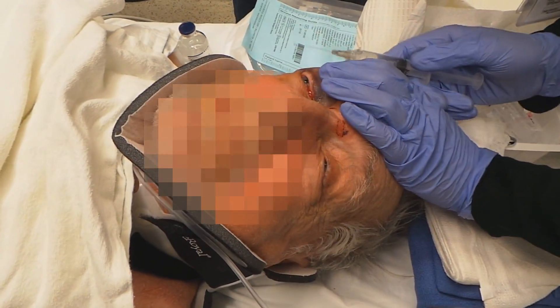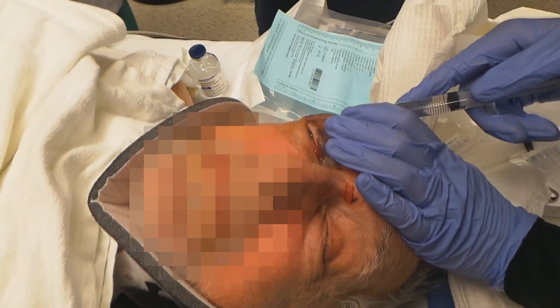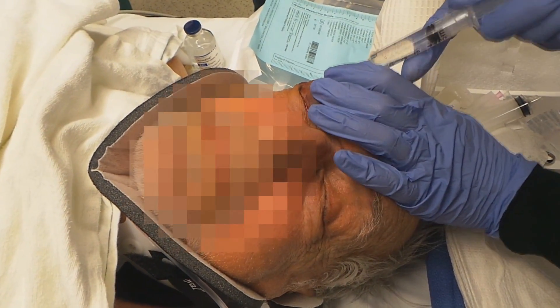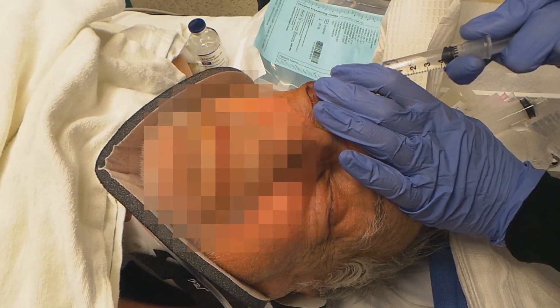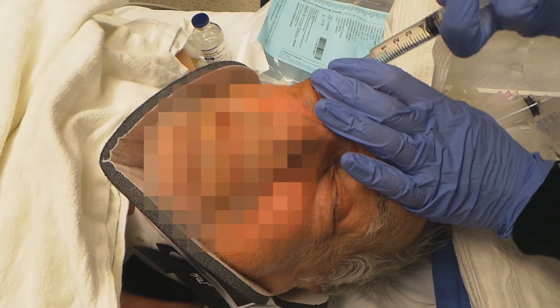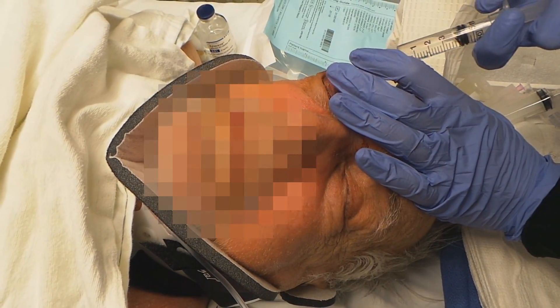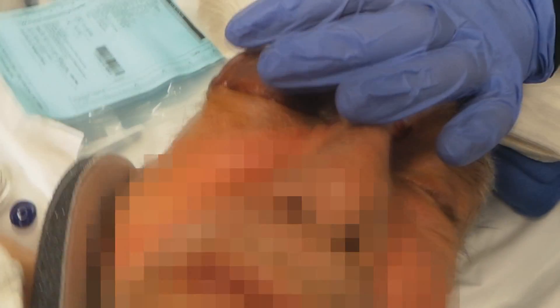You're going to feel a little sting and a burn here, okay? So your indications for the lateral canthotomy: total loss of vision, lack of extraocular motion, lack of pupil reactivity, proptosis. Evidence of a retrobulbar hematoma with decrement of vision.